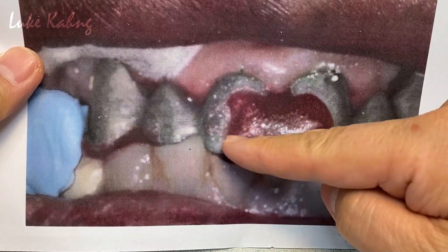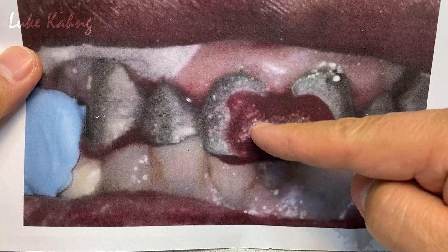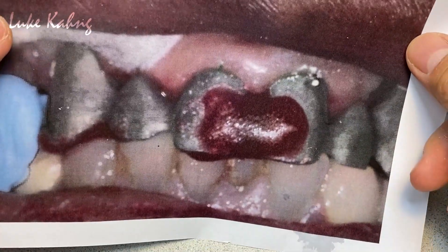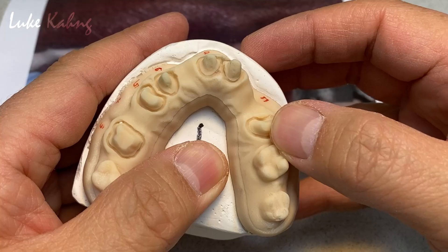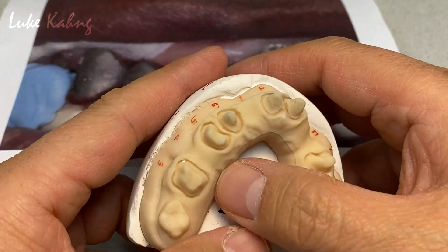This one is kind of a bite record. Whenever they make the resin pattern over the top of the metal framework, they take the bite, so we re-articulate it and double check. Sometimes this framework — being a long-span framework — has a little bit of distortion and rocking, so we have to weld it sometimes.